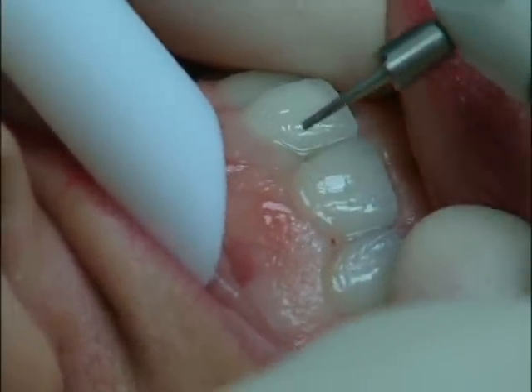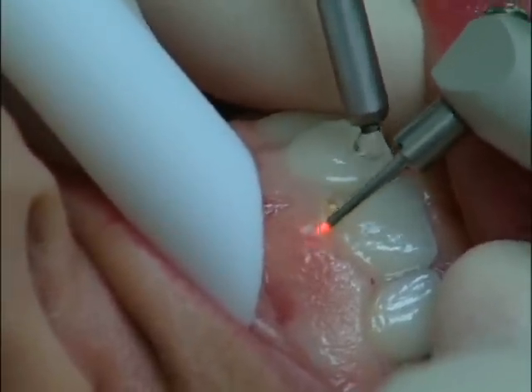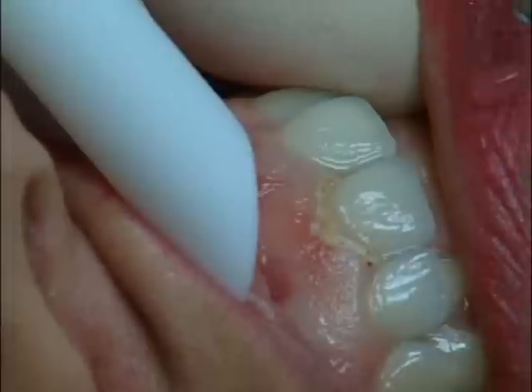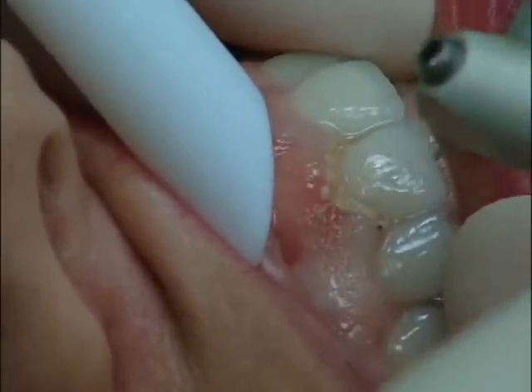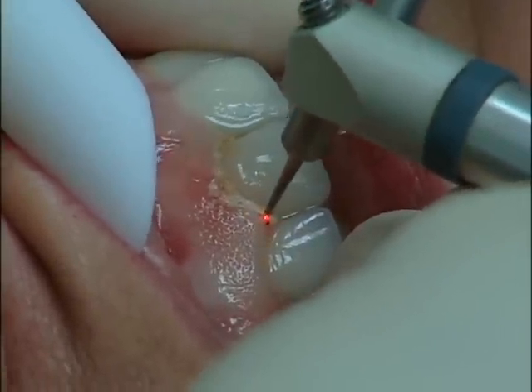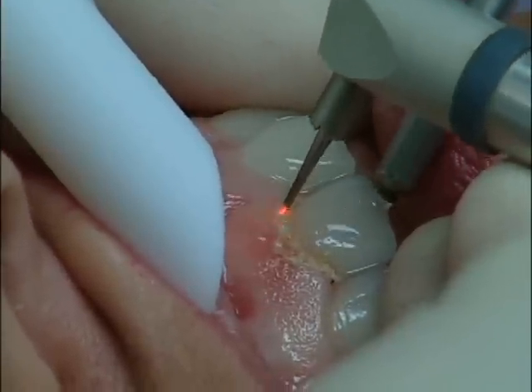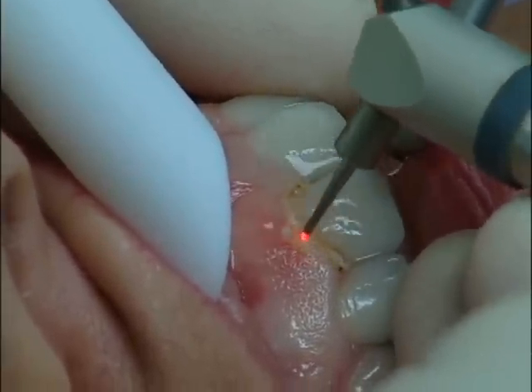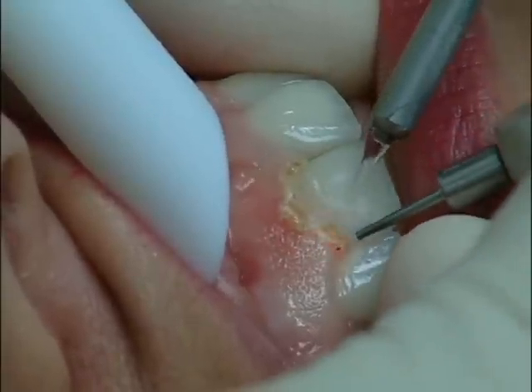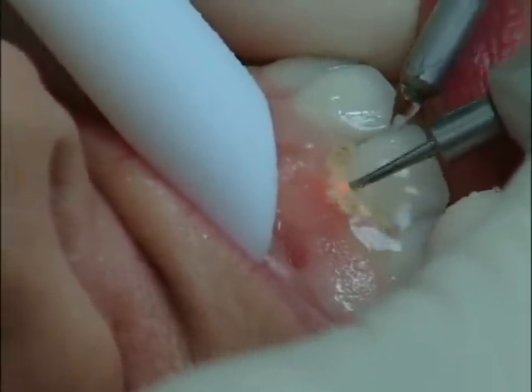Can you hit the operate button for it again? Now she has topical anesthetic only, so everything we're doing now is... How are you doing, Janet? Fine. A little less, a little less, a little less.